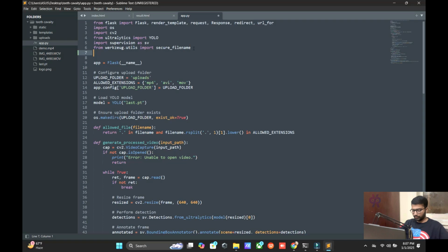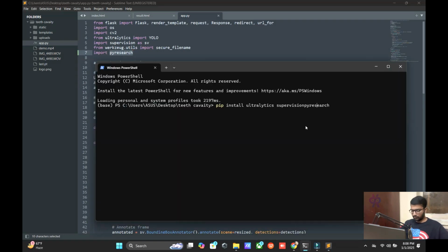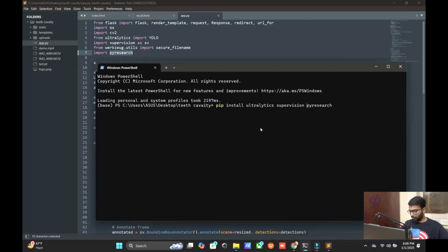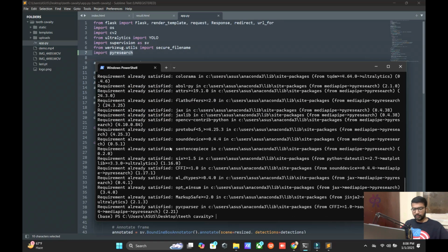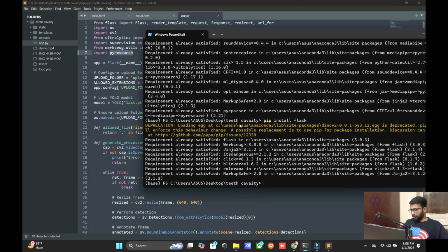Here import. The Pyresearch library is also needed. And let me close the previous terminal and install it. I have already successfully installed all dependencies, but you can install all the dependencies. Pip install flask. Okay, so finally we installed all dependencies.